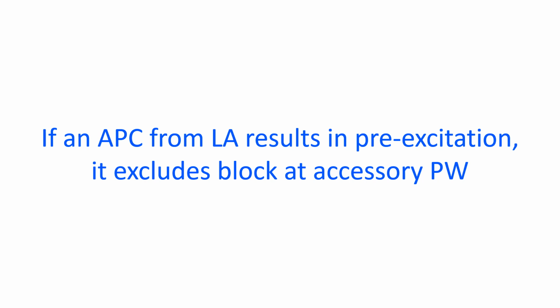1. If an atrial premature complex from left atrium results in pre-excitation, second factor is negated. 2. Notched P wave has been suggested as an evidence of interatrial conduction delay or delay at Bachmann bundle. Left lateral pathways are well known to have no pre-excitation on surface ECG due to some of these reasons and may manifest with atrial pacing only. Then it is known as latent pre-excitation.